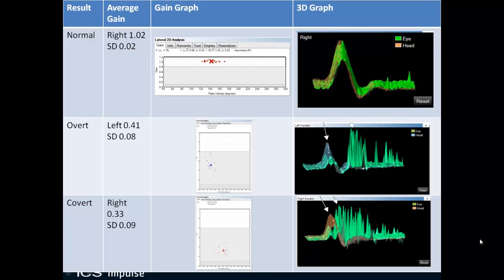Comparing normal versus overt versus covert: in a normal response there are no saccades. This is a right-side head impulse with orange for the head and green for the eye; the mean gain is 1.02 with a standard deviation of 0.02, all within the white region. For overt catch-up saccades the saccades occur after the head impulse stops, with a left gain of 0.41 (SD 0.08), all gain points in the gray region. For covert saccades, they occur during the head movement, with a gain of 0.33 (SD 0.09), all in the abnormal gray region.